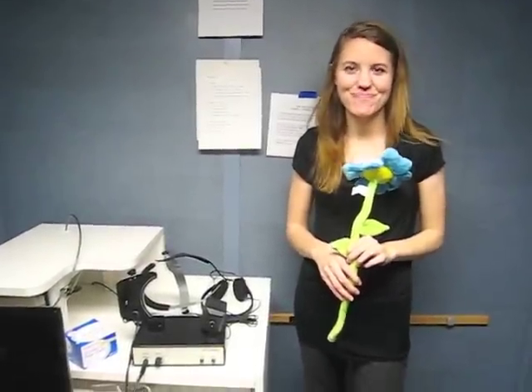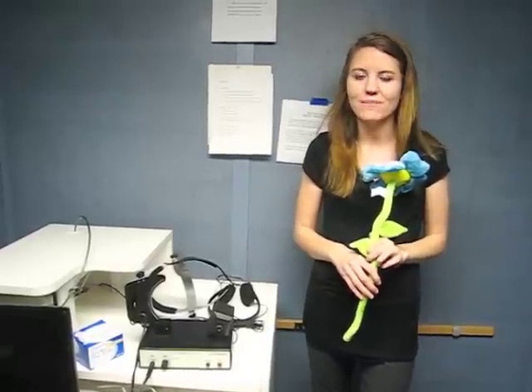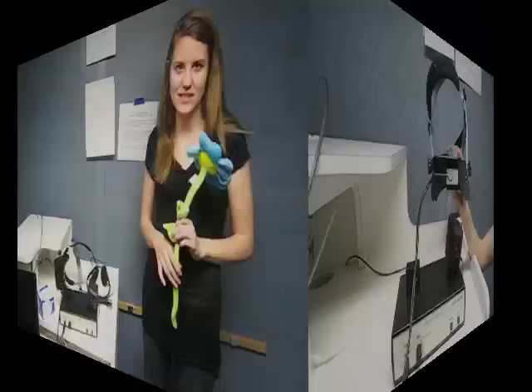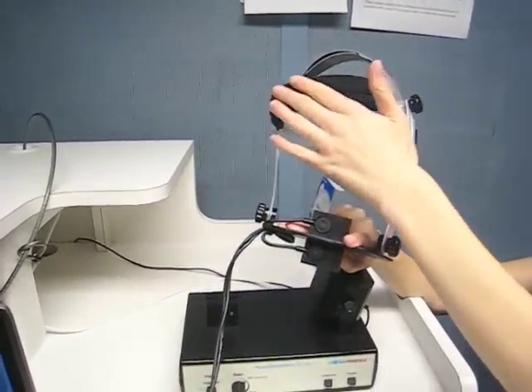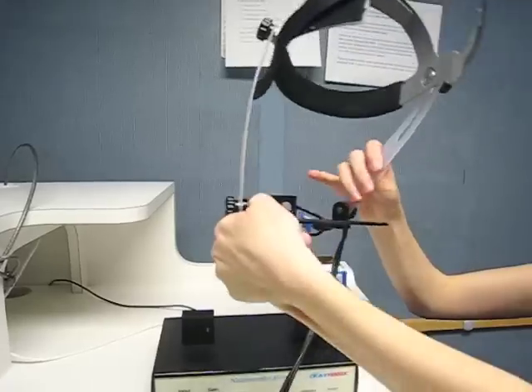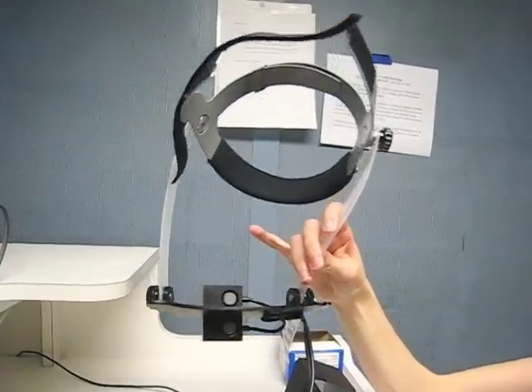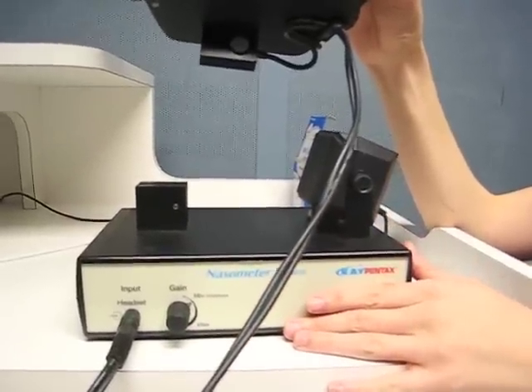Now presenting the Nasometer 6450. It would be really great if the nasometer would turn on and everything would be up and running by itself, but sadly it's not that simple. This is the headset, this is the headband, this is the harness. These are the adjustment knobs. Down here you can see the microphones for the oral and nasal acoustic energy. This is the speaker. This is the Nasometer 2 external hardware box.